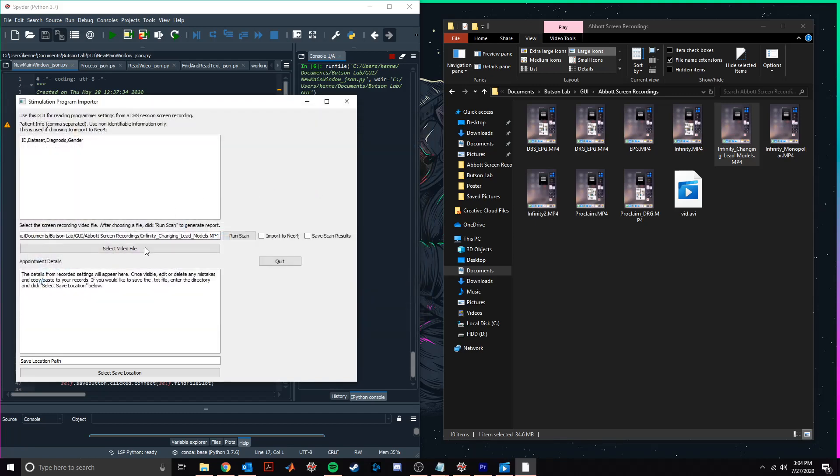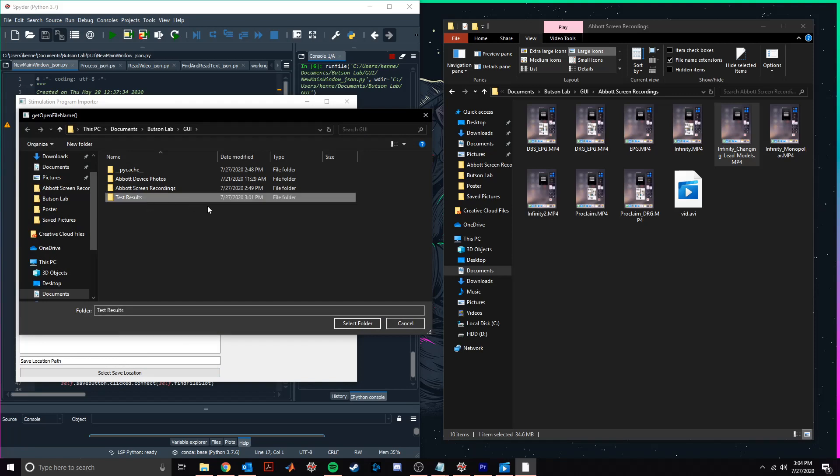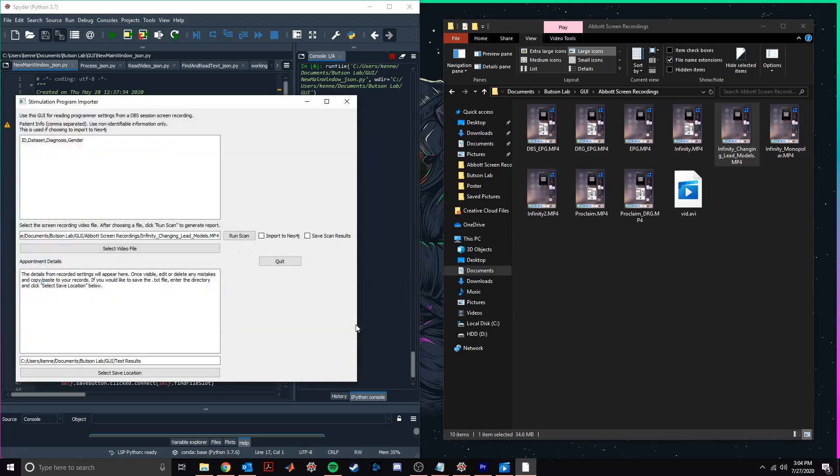Next, we'll select a location to save our output file that contains the record of our device settings. And finally, we'll choose to save our scan results and run the scan.